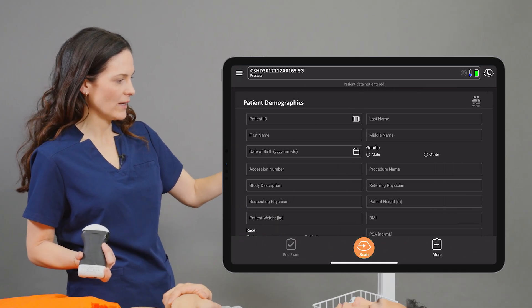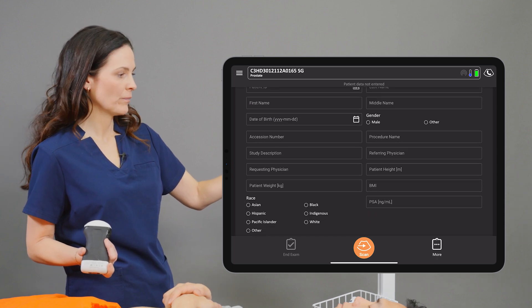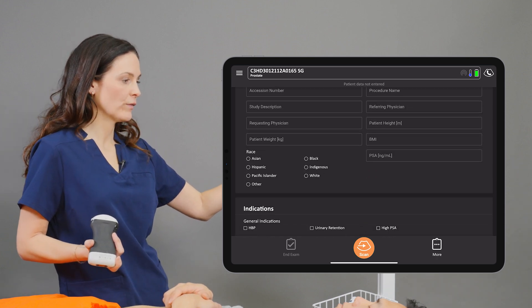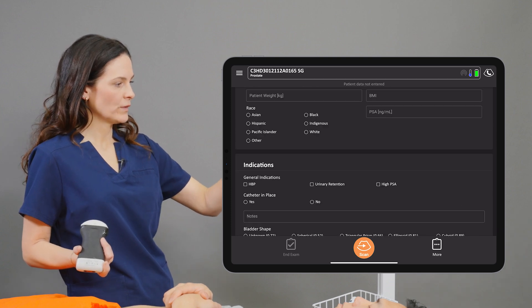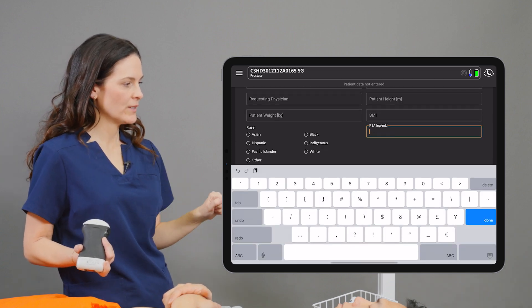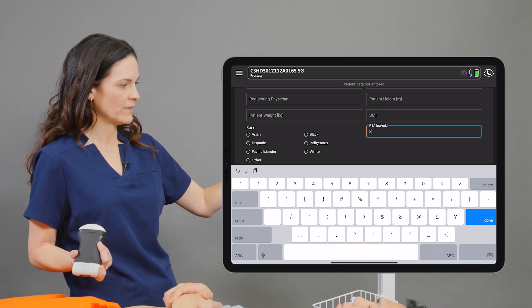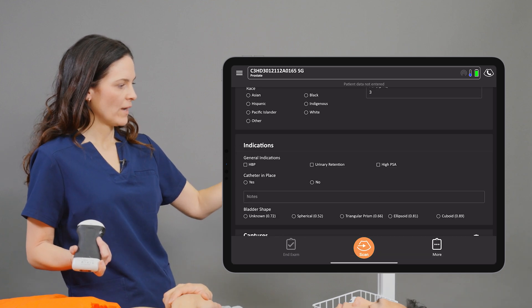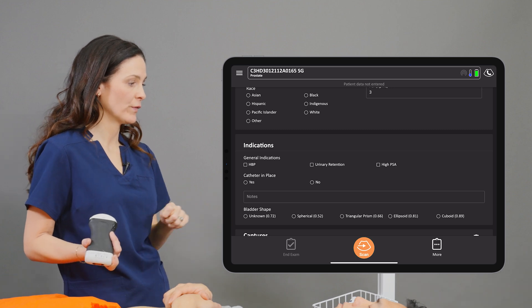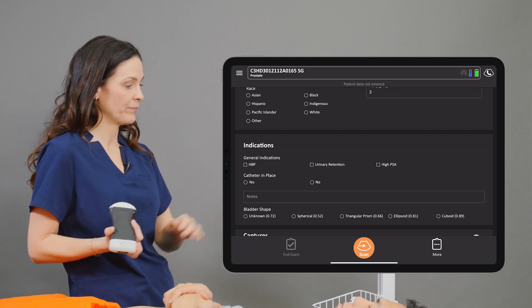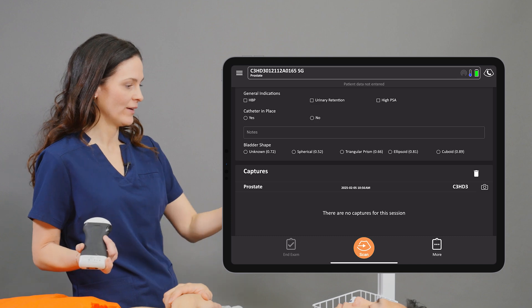We'll start at the patient demographics page and this is where we would enter the patient's name, birth date, and any other relevant medical information. When we scroll down we can see there's an area here to enter the patient's PSA levels. I'll enter three for the purpose of today's exam. Under the indications header we can see some areas where we can fill in indications for the prostate exam. We'll come back to this page at the end of our scan.